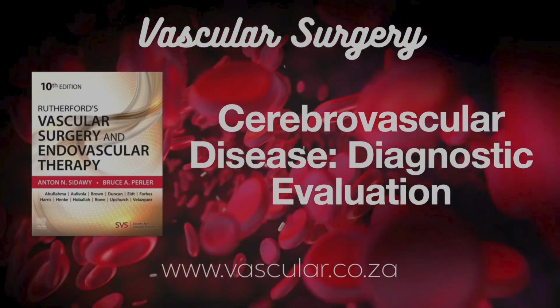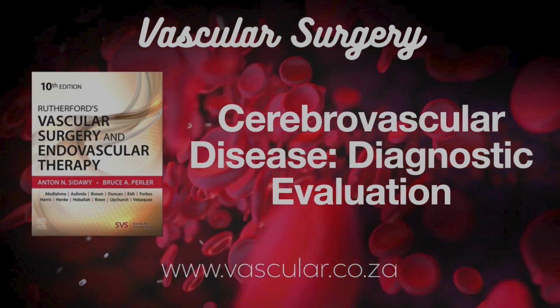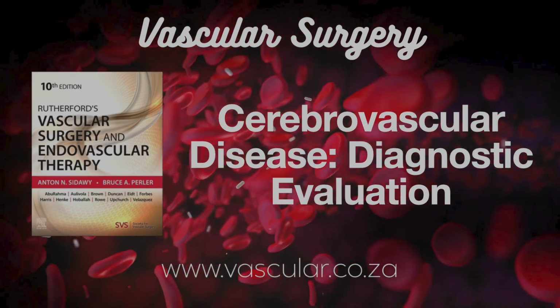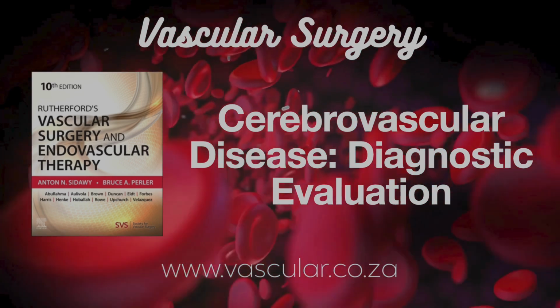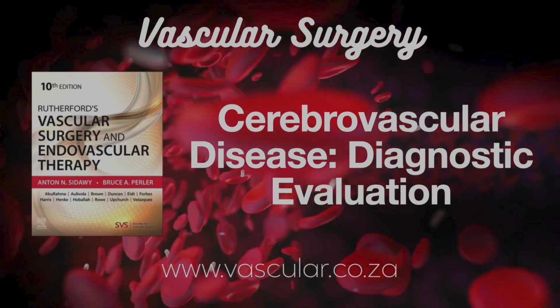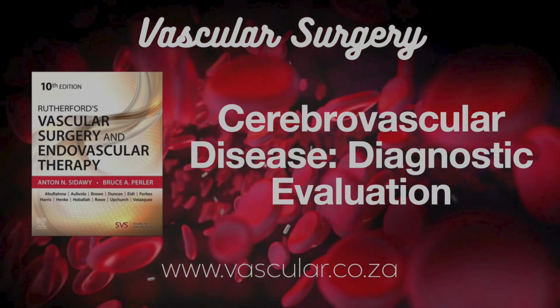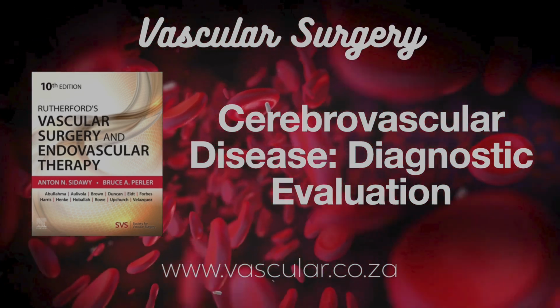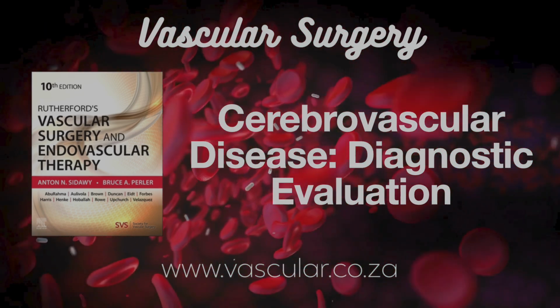So the bottom line is? The bottom line is, routine diagnostic catheter angiography just doesn't have a role in standard cerebrovascular evaluation anymore. The potential benefit really has to clearly outweigh those risks for it to be justified. Makes perfect sense. Reserve the big guns for when they're truly needed. Okay, let's shift gears to magnetic resonance angiography, MRA. How does this fit in?